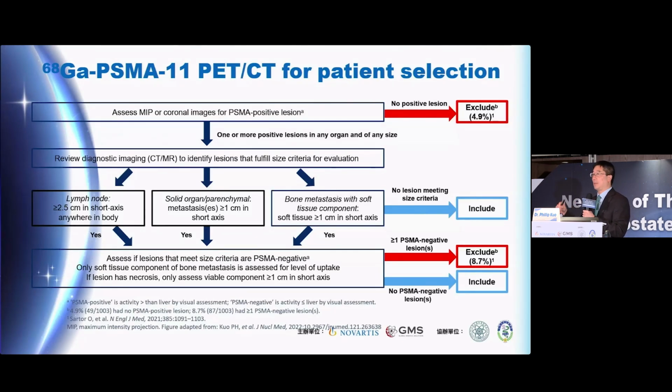And what does that mean? It means this tumor or metastatic deposit has enough PSMA expression that if we then treat it with 200 millicuries of lutetium PSMA 617, we believe we will give enough gray to that tumor to make it respond. So we actually define PSMA positive in a way different from diagnostic utilization, but instead for theranostic purposes. Greater than liver visually.